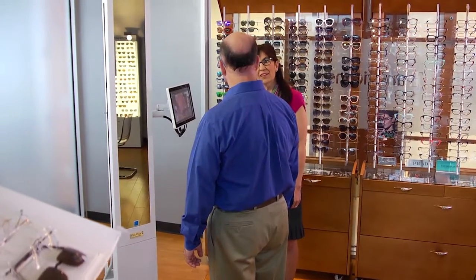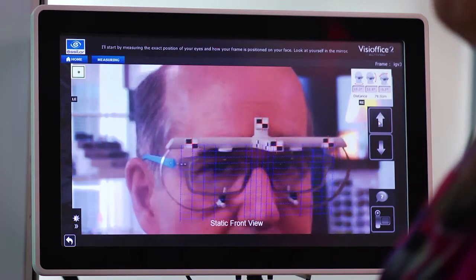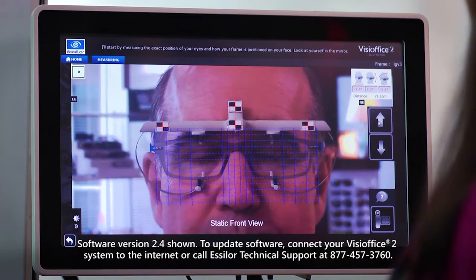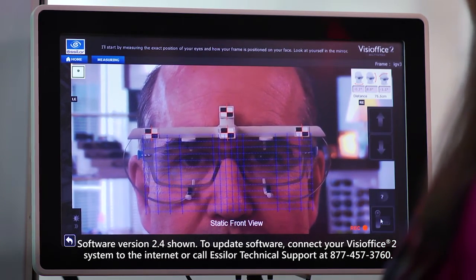To complete basic measurements, you'll need to take two photos: the front view and three-quarter view. I'll start by measuring the exact position of your eyes and also how your frame is positioned on your face. So why don't you look in the mirror for me. Have the patient look at themselves in the mirror, then select the camera icon to start the measurement.